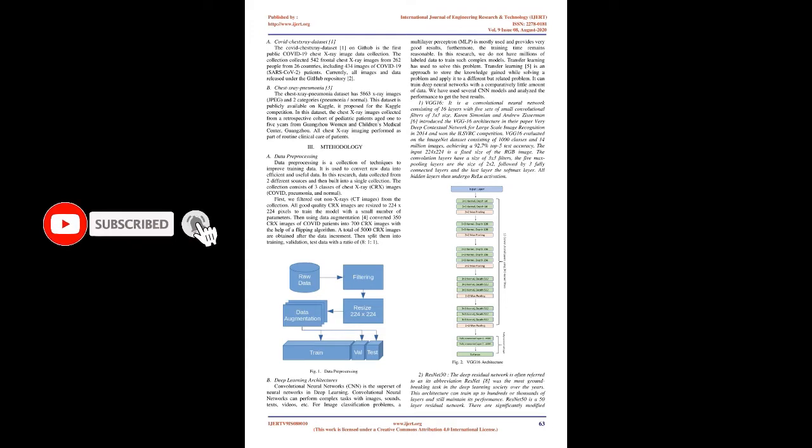Not all images available in the dataset are used; some poor quality images and non-X-ray images are removed before training the network. The network performs well after removing poor quality, non-X-ray images from the datasets. In this research paper, we have acquired 4,650 chest X-ray images from 2 different sources.